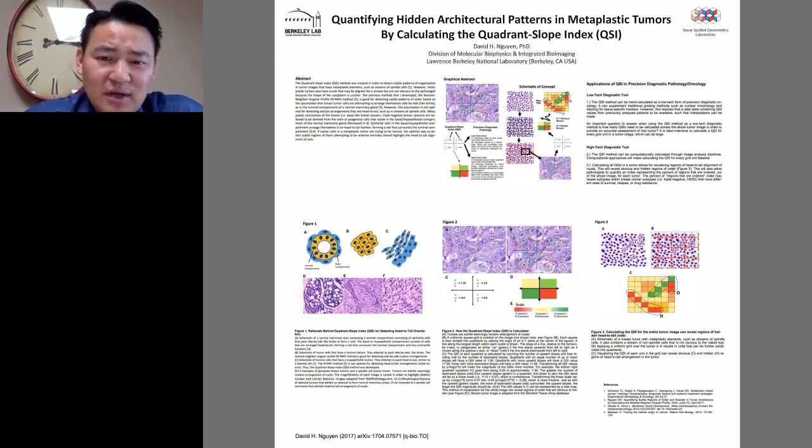And there are a lot of large archive data sets of tumor images that also correspond with the patient data as to age and disease stage and how long they lived and how long they lived before relapse happened, such clinical information. Having that data, we can perform the QSI measures and create a benchmark, a table such that somebody, whether they calculated the QSI using a computer or by hand, has a table in which to interpolate the severity of a patient's tumor and what the recommended treatment options are in light of the QSI index.